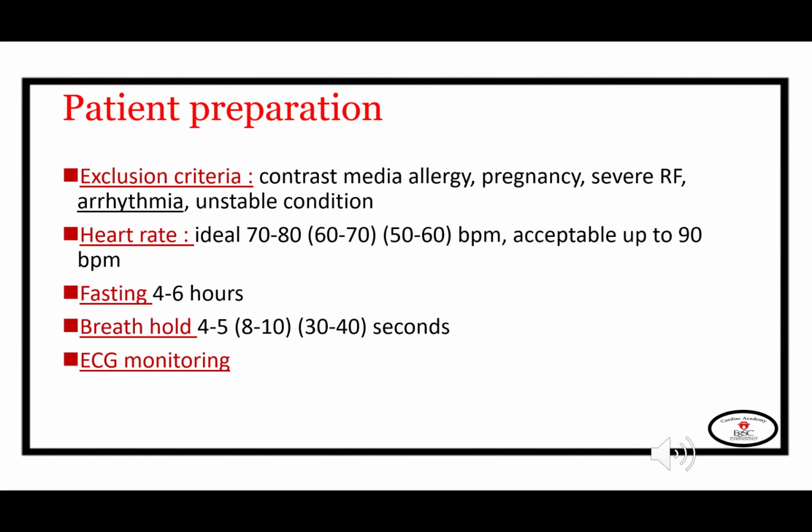To prepare the patient, we have to exclude patients who are not suitable for this type of radiation exposure and contrast material administration, such as patients with contrast media allergy, patients with renal impairment, pregnant women, and the presence of arrhythmia is actually very unique to this technique because the technique depends on having a steady regular heart rate. As we can see later, we can take the images from different heartbeats, not just a single heartbeat.